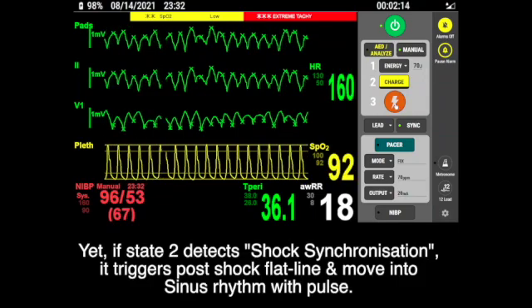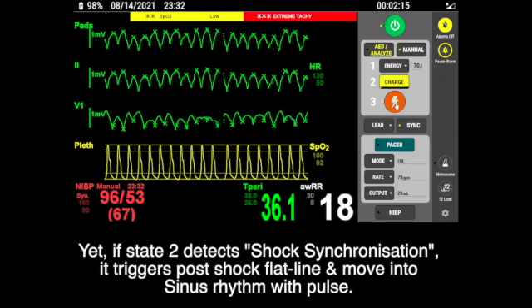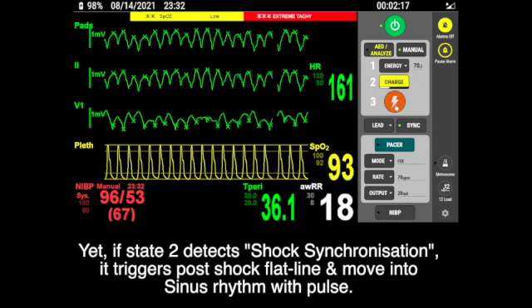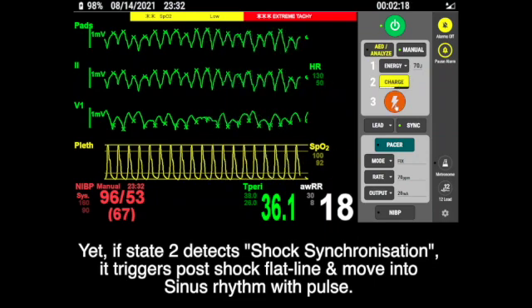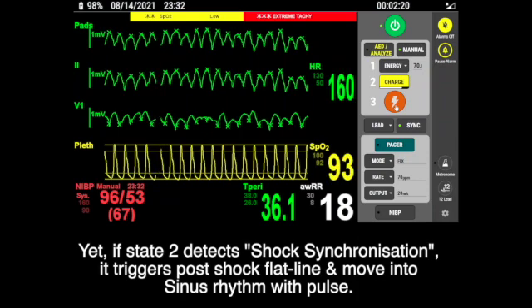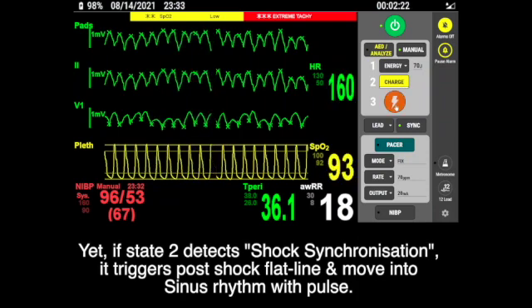If state two detects shock synchronization, it triggers a post shock flat line and moves into sinus rhythm.